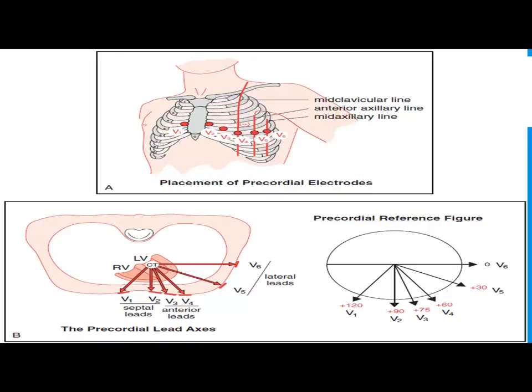So what you have to imagine in your head right now is that we're kind of going to the middle of the left ventricle, and we're taking a view from that part out to each one of these. So if my left ventricle is right there, on V1 and V2, I'm getting a view of the septal wall, which is higher up, right?